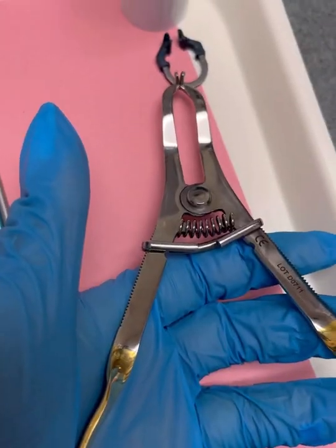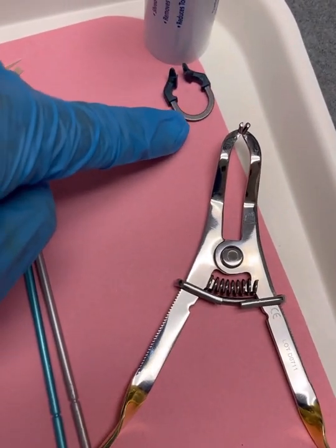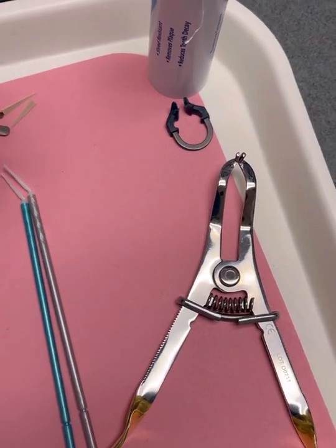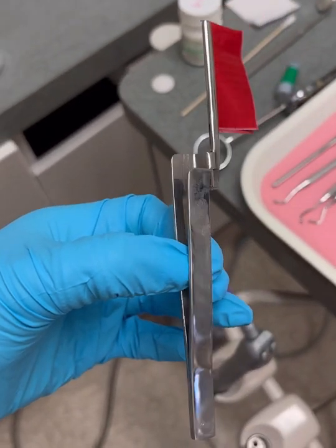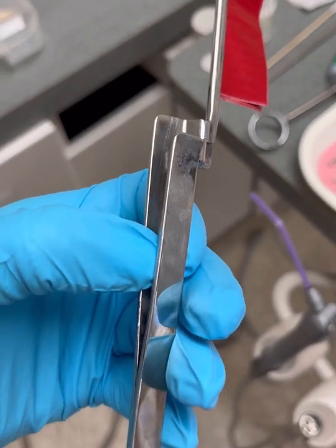You will then remove wedge and matrix, light cure 20 seconds, transfer the dental dam forceps, and wipe the patient's face upon removal of the dental dam. You will then transfer the articulating paper to the operator to check occlusion and bite. You can adjust the restoration as needed with a football diamond burr.